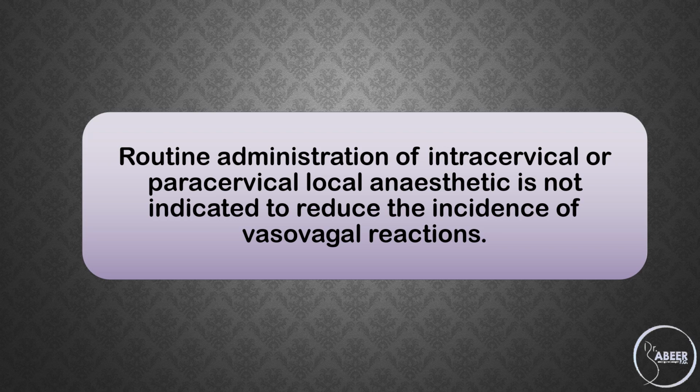Routine administration of intracervical or paracervical local anesthetic is not indicated to reduce the incidence of vasovagal reactions.